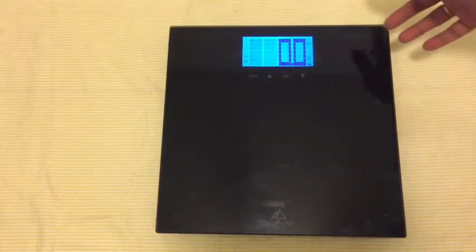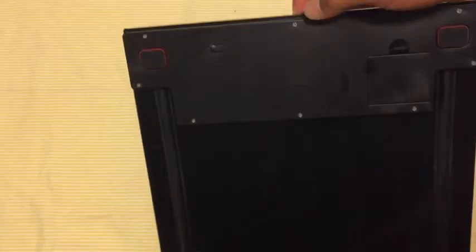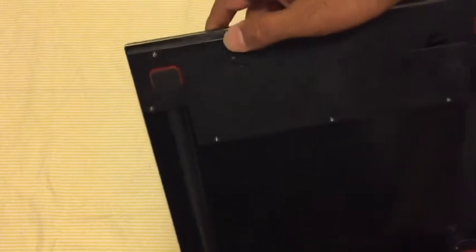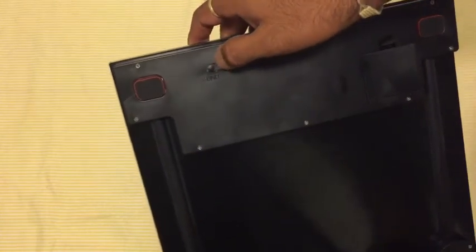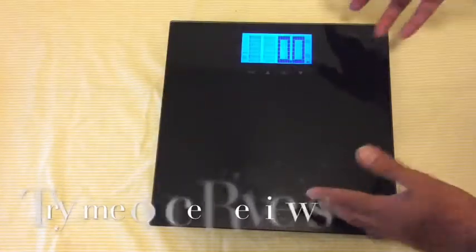Once you turn it on, there are sensors on the back, and it comes up with a hello message quickly. Looking at the back, you can see the weighing sensors, the battery compartment, and the unit button. You press this button to change the unit, and the scale turns on as soon as you step on it.